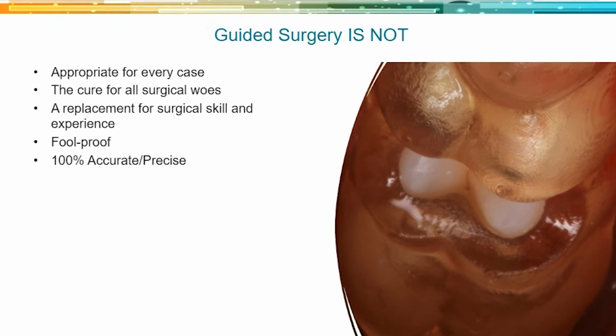Your hand is still getting forced because we have to respect the hard tissue, the bone, the biology, and the actual surgical outcome. So things like that. We don't want to just become like, oh, if I put it in the software, that's where it's going to go. Okay, that's not the case. And certainly they have failures as well.